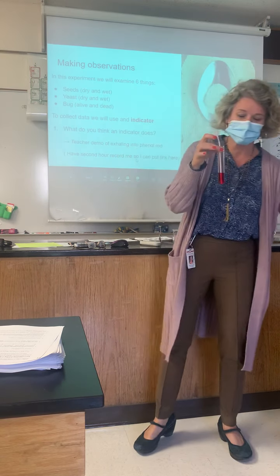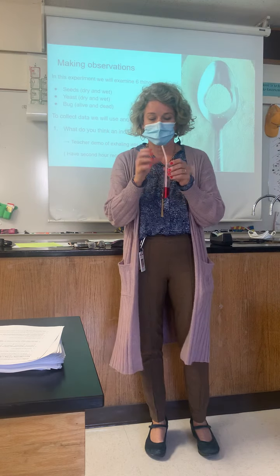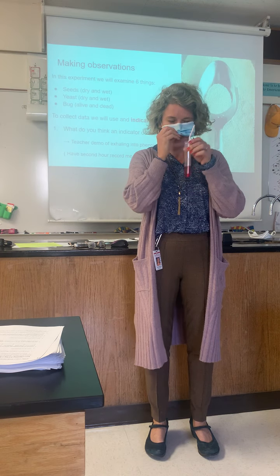This is the phenol red in here. Notice the color of the phenol red.